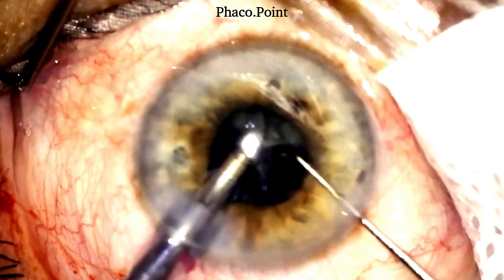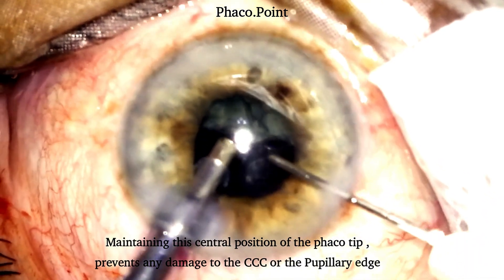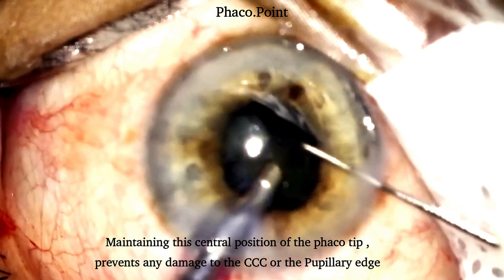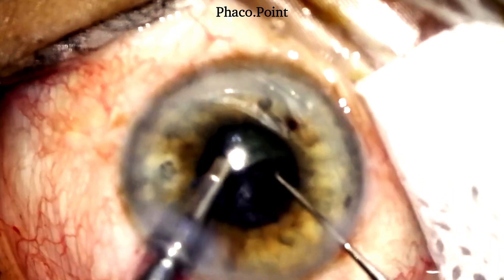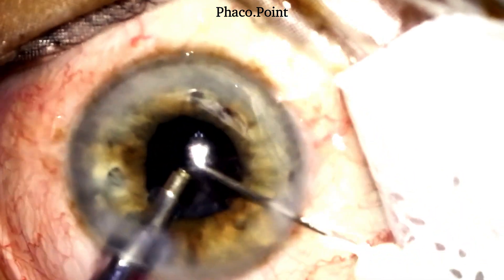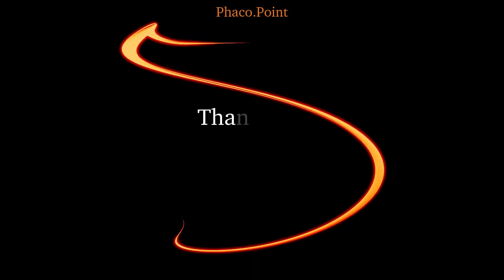At no point is the phaco tip close to the pupil. This is a very important consideration which helps prevent accidental damage either to the pupillary edge or the anterior capsular edge hidden under the pupillary margin. Phaco-emulsification in a small pupil should be done slowly, with care and caution, at all times maintaining complete control. I hope you found these tips on safe nucleus emulsification in a patient with a small pupil useful. Thank you.